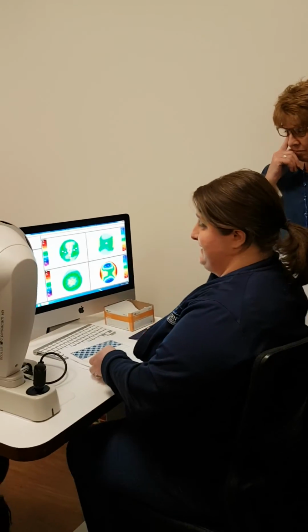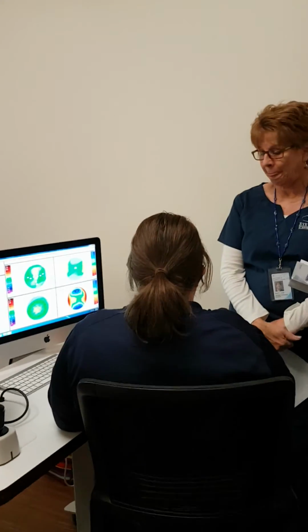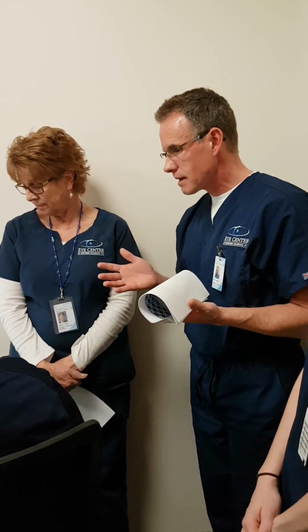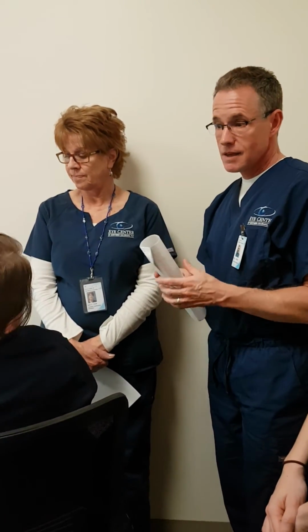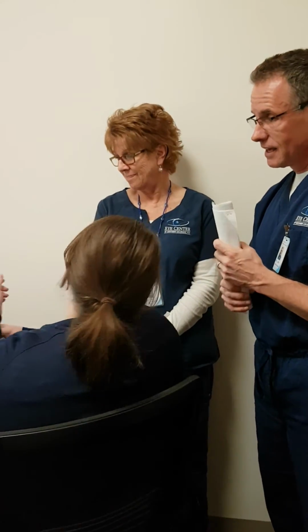Any other questions? Can I ask about the Belin? Is that how you pronounce it? Sure. Some of the texts have said some doctors like both all the time, and maybe I'm mistaken, so I've been doing both every time, just to make sure that it's there if they need it. That's not a bad idea, but it does take time to do that.